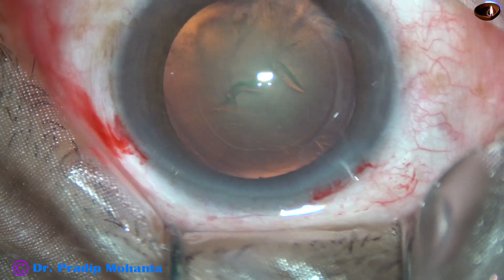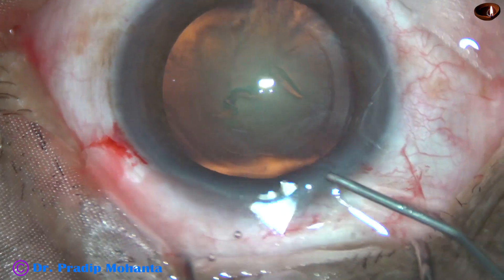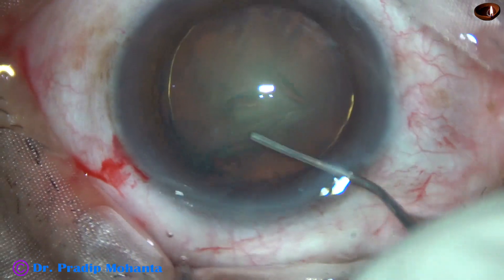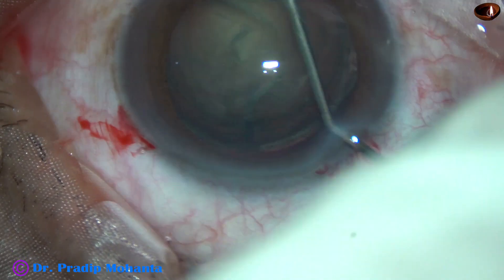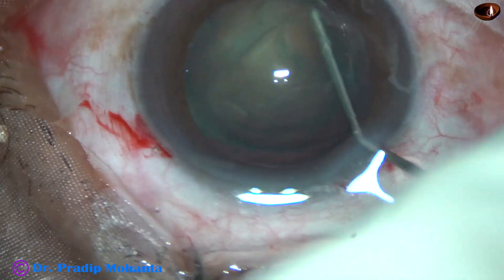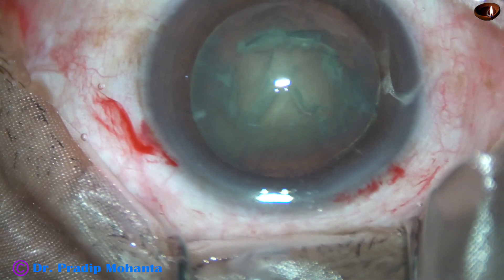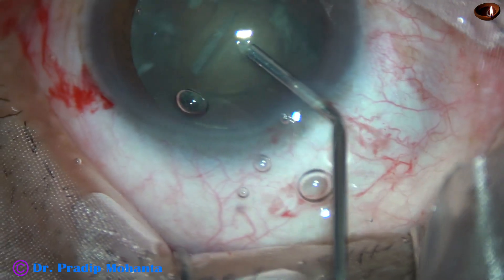And now, hydro-dissection. Hydro-dissection is being done with BSS and a 27-gauge cannula fitted to a 2cc disposable syringe. Hydro-dissection was successful in this case, and it has produced a beautiful golden ring.